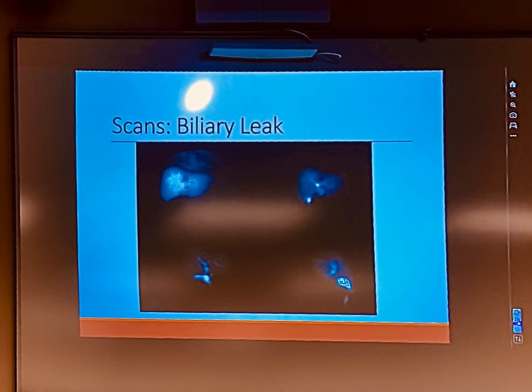How do you know the patient doesn't have a gallbladder? Because from those images, I would think that was a gallbladder. Because you know when the patient comes. First question you ask your patient is, do you have your gallbladder out? But when the surgeon is looking for a biliary leak, it'll actually say in the comments, rule out leak. So you'll know.